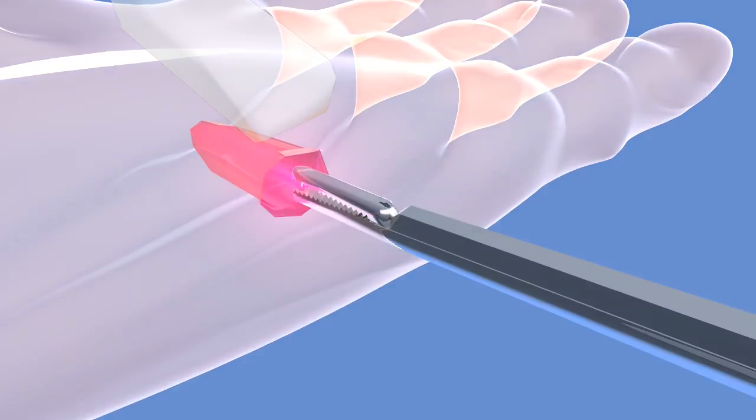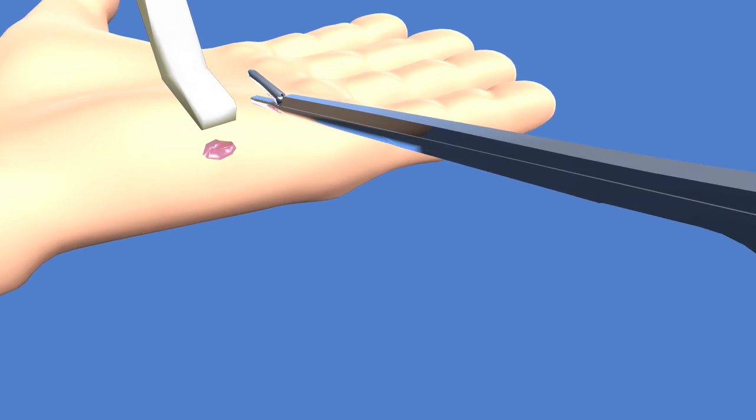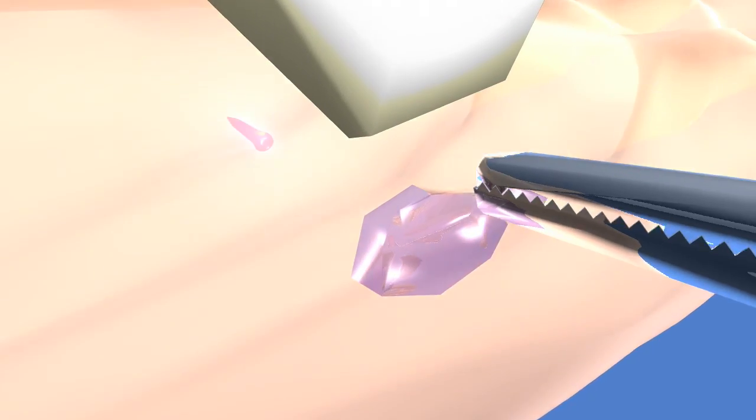Again, through a small incision, the alligator forceps are introduced under ultrasound guidance, which demonstrates sonographically the forceps and the wood foreign body.